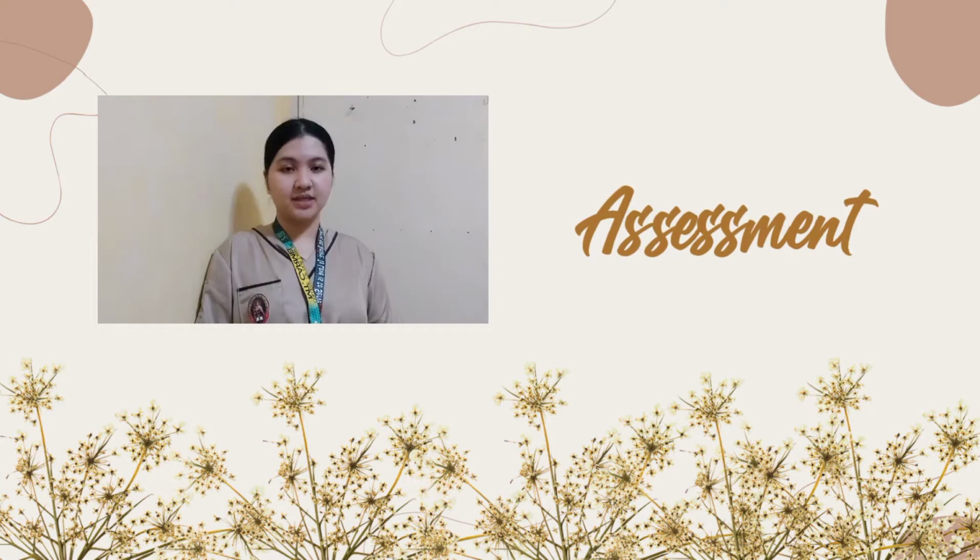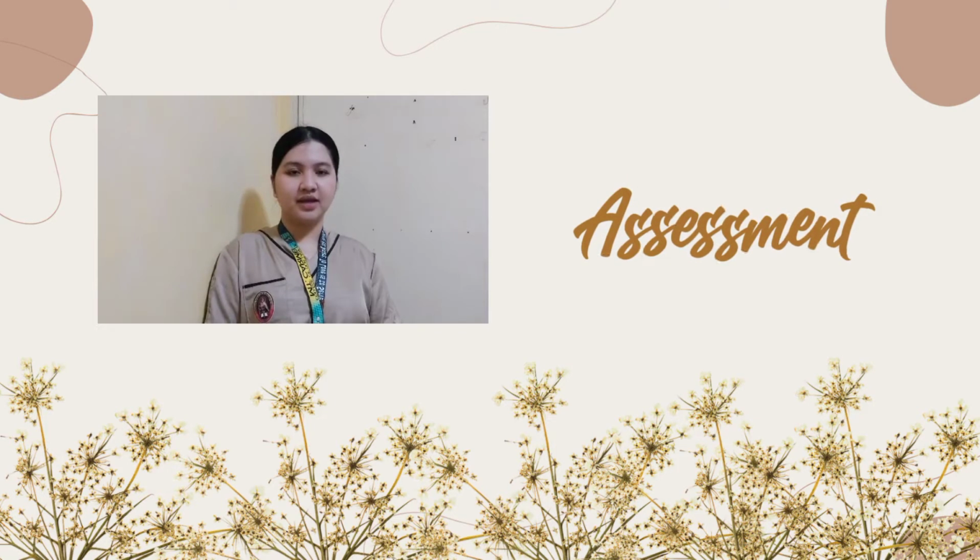So first, for the assessment part, we need to assess the best location for a pulse oximeter sensor based on the client's age and physical condition. Unless contradicted, the finger is usually selected for adults. Second, the client's overall condition, including risk factors for development of hypoxemia. Example, respiratory or cardiac disease and hemoglobin level.